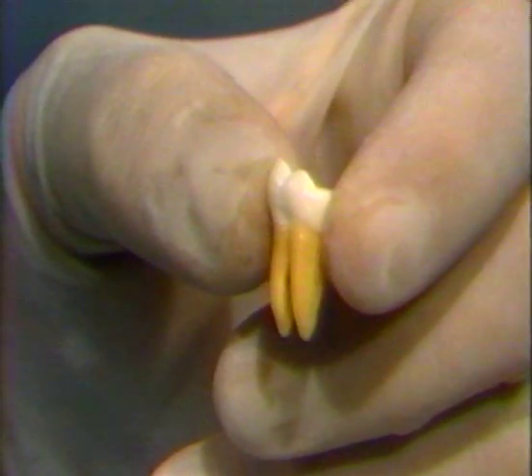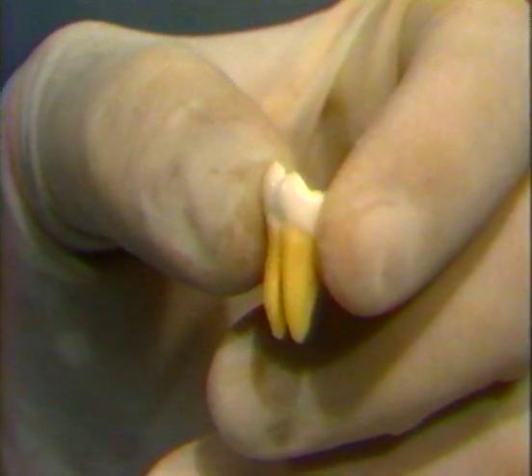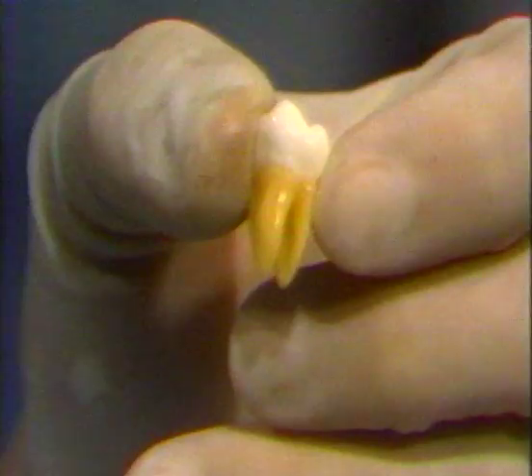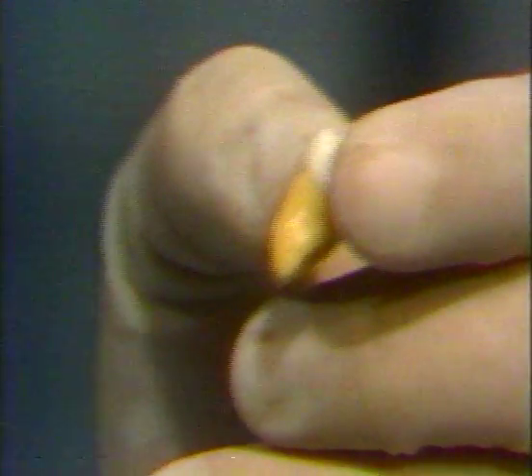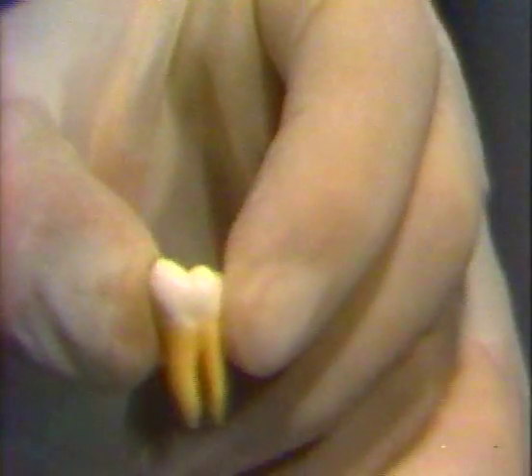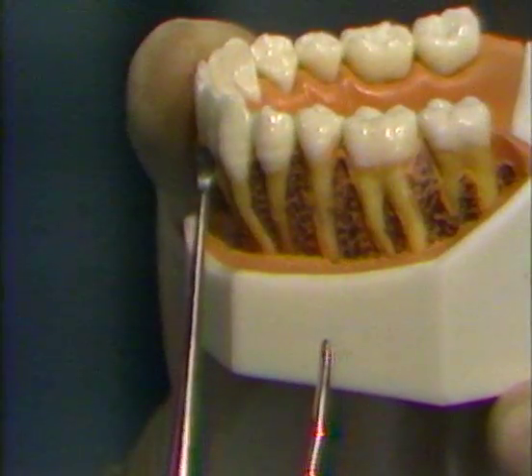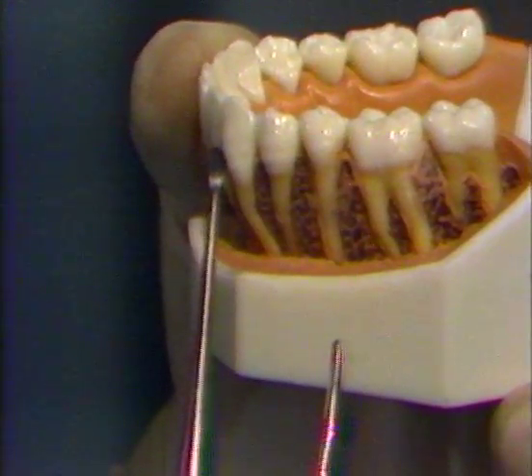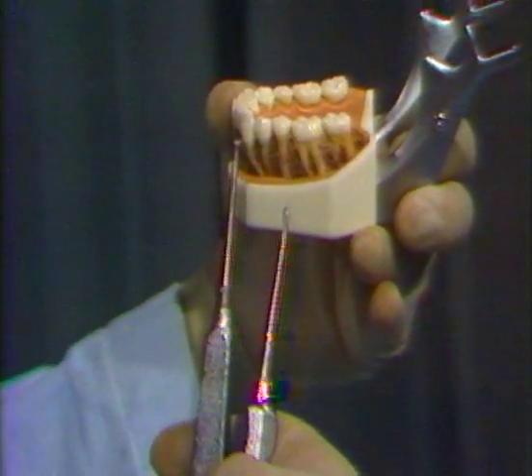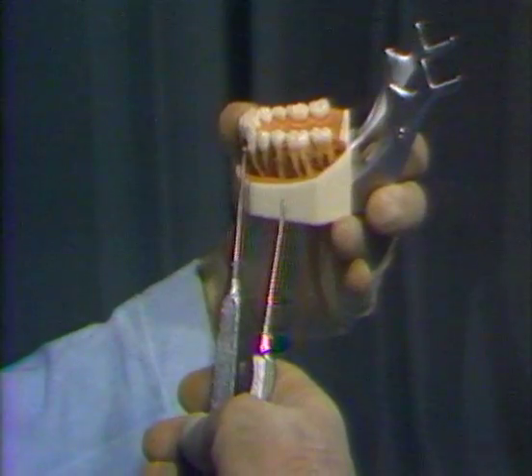The luxation movements for the first and second molars are similar, the only difference being that the first molar, being a larger tooth with more pronounced root structure, will usually require more force in its removal than the second molar. The use of the number 2 Molt Curette and the number 301 elevator is the same as demonstrated in the removal of maxillary teeth.